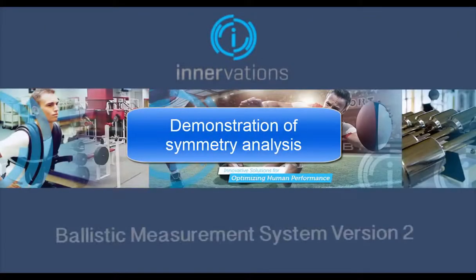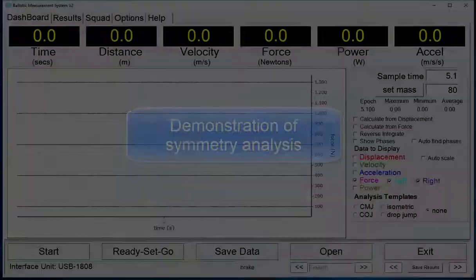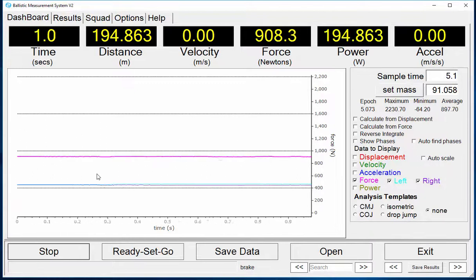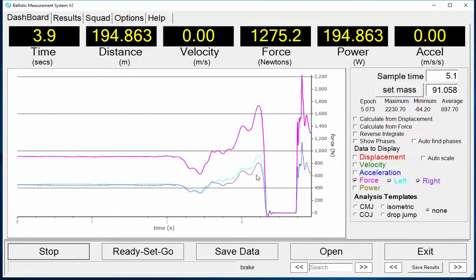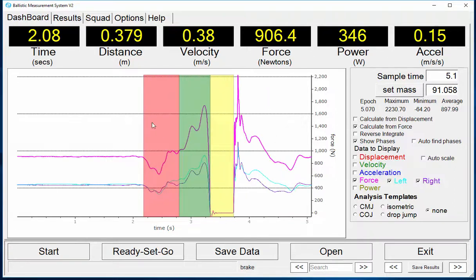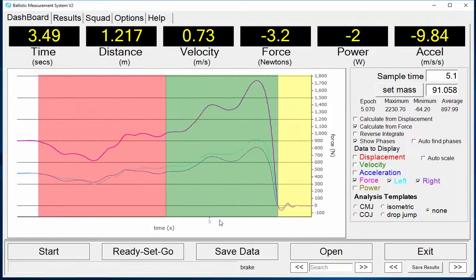Here we demonstrate symmetry analysis of BMS version 2. Two additional graph options have been added to display the left and right force output independently. When recording a trial, the total force, left and right force traces are recorded and displayed.